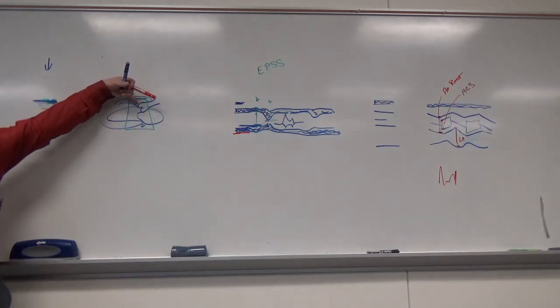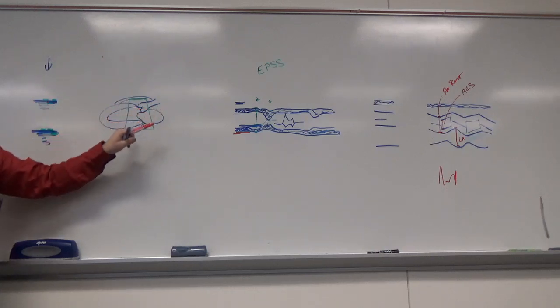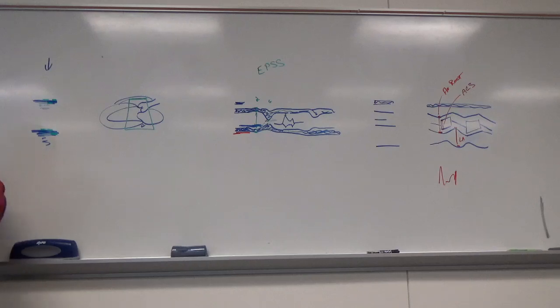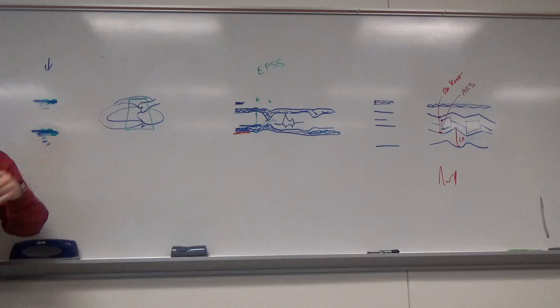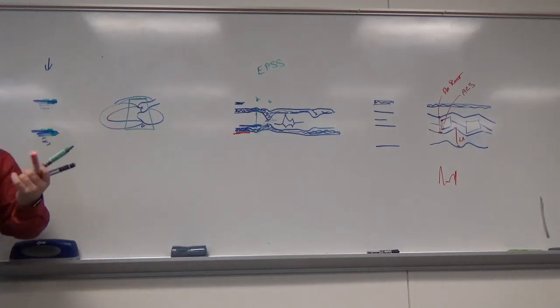So include a little bit of right ventricle. I don't need the rest of it though. It's going to be narrow enough to cover both of my valves. I need to see both of those, and I need to see a little bit past them because if there's a leak or a jet, I need to see where that jet is going. I don't want to cut it off right at the tips. And then you want to see a bit of the posterior wall. So you want to see the structure you're interested in plus a little extra, and that's all you need. Okay, so we're going to zoom into that, and then we're going to stick on color.